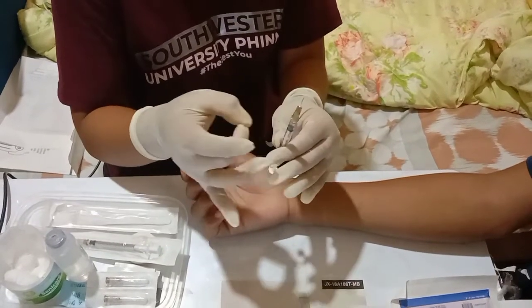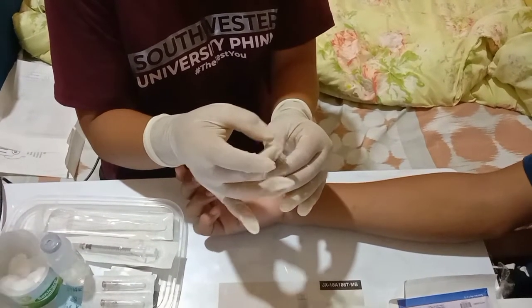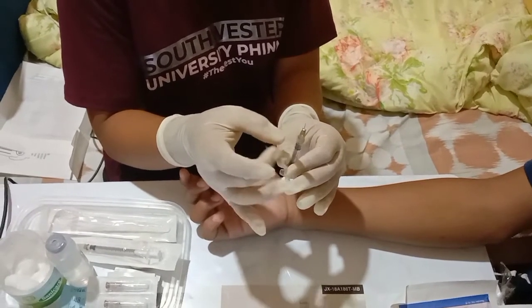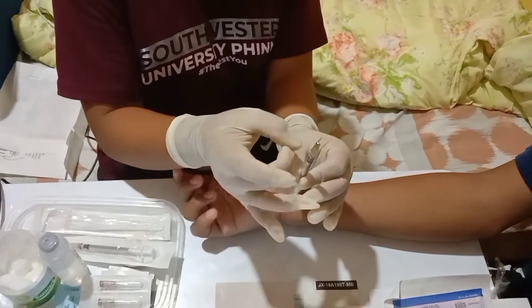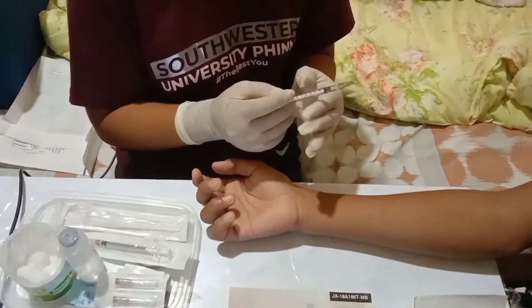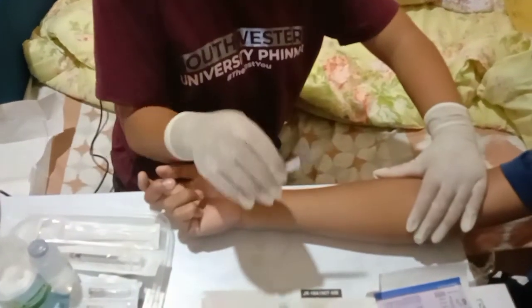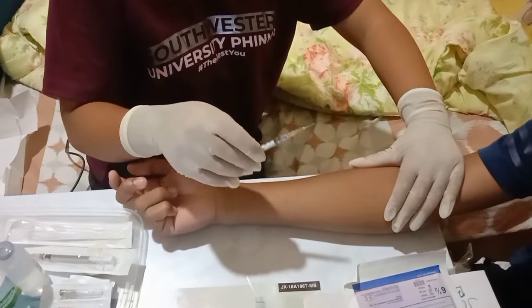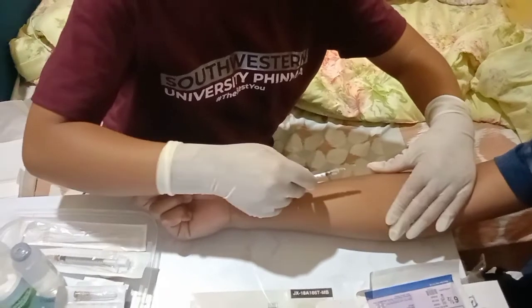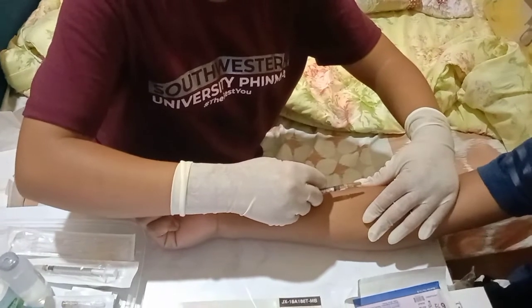Small bubbles that adhere to the plunger area are of no consequence, because a small amount of air will not harm the tissue. Grasp the syringe in your dominant hand and close to the hub, holding it between the thumb and forefinger. Hold the needle almost parallel to the skin surface, with the bevel of the needle up.